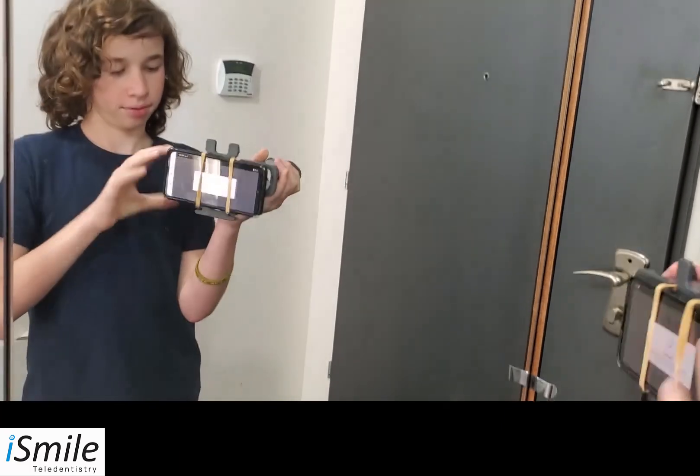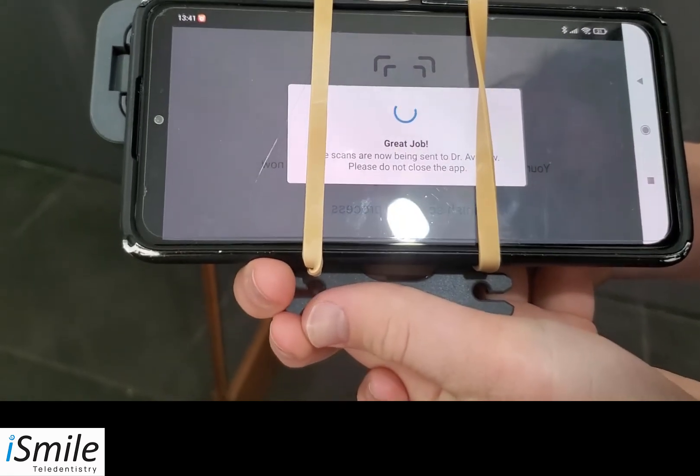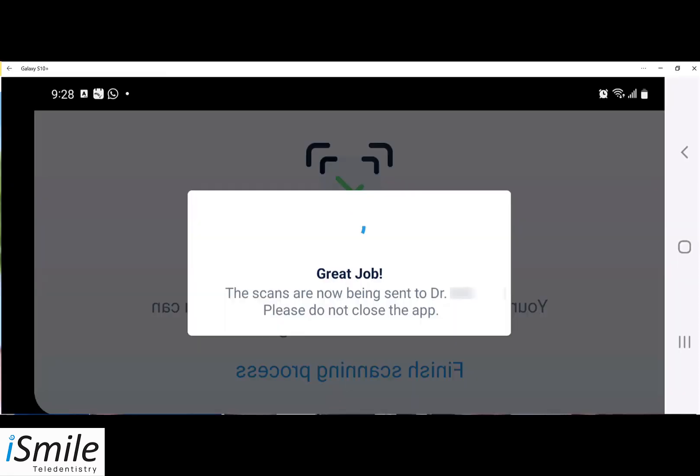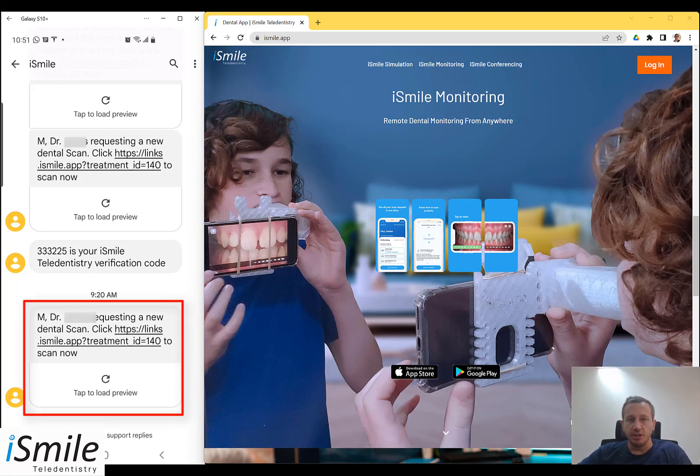Once you finish the process, click 'Finish Scanning Process' and the scans will be sent to the dentist. Keep the app open until you receive confirmation on screen that the transfer is complete. And that's it — you've completed your first scan. The next time your dentist requests a new scan, you'll be receiving only one message. Simply click on the link in the new scan request to open the app and perform the scan.